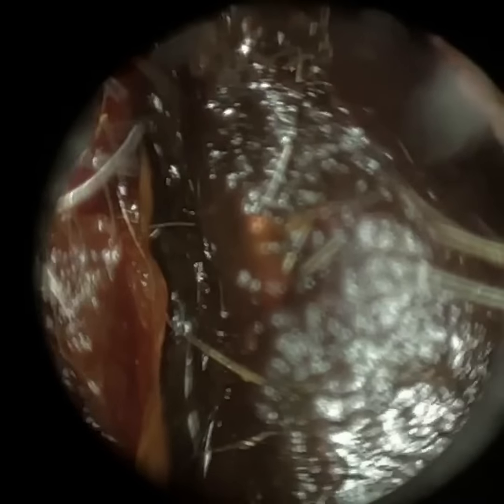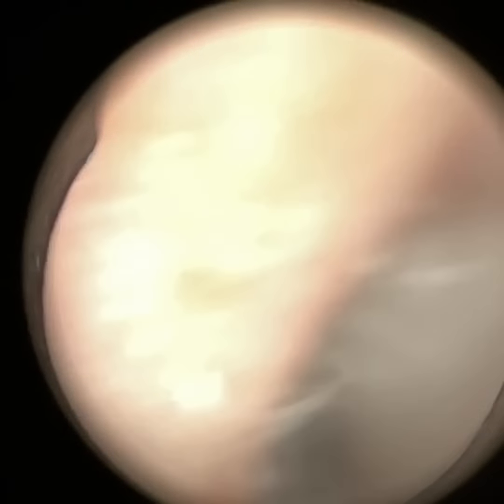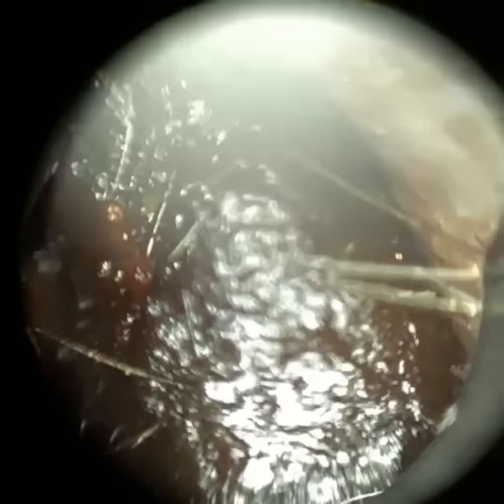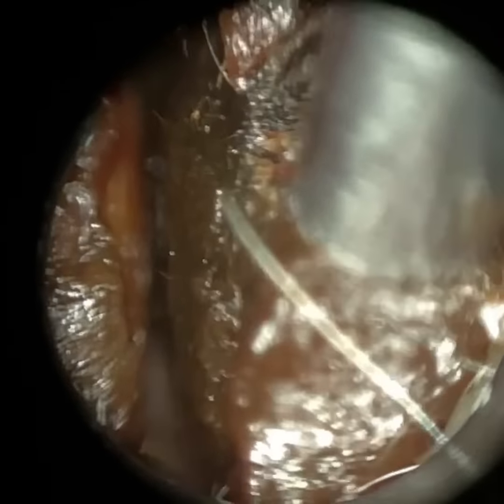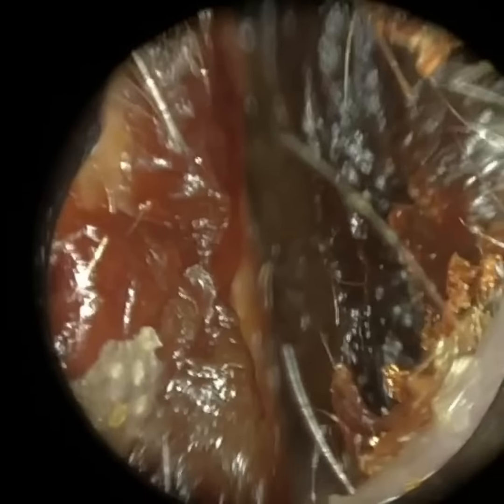Here we have a patient who attended with a very narrow ear canal. This patient is a regular patient who normally attends every 18 months, and my clinical notes highlighted that they have very narrow ear canals. I thought this is going to be a good test for the WaxScape, because in essence this is why the WaxScape was developed — with the endoscope, some specialists can struggle to stretch the ear open as you don't have a speculum; you're having to use the endoscope itself to stretch the ear open.